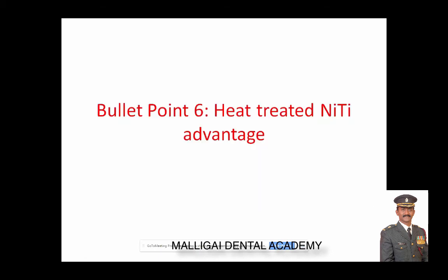Bullet point 6 of today's webinar: heat-treated nickel titanium advantage. What do I mean by the heat-treated nickel titanium advantage? Currently, we are in the second generation of nickel titanium rotary files, and my recommendation to all of you in your modern endodontic practice is to start shifting from the generation 1 nickel titanium files to the generation 2 nickel titanium files, which are the heat-treated nickel titanium rotary files.